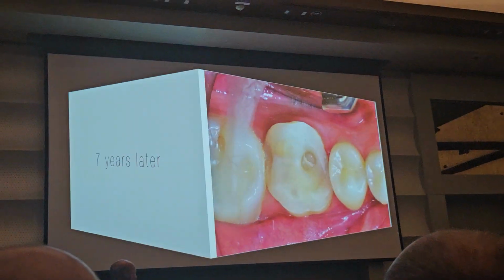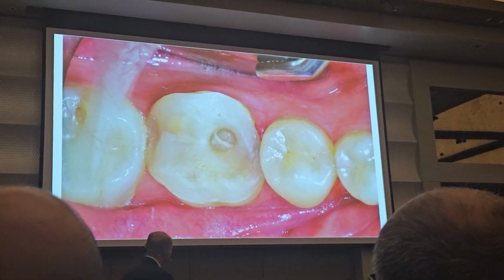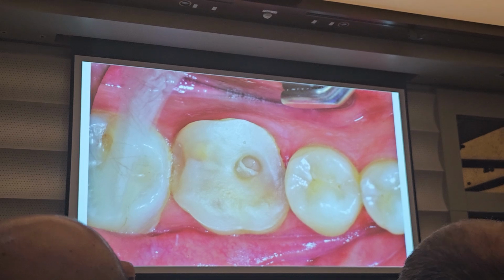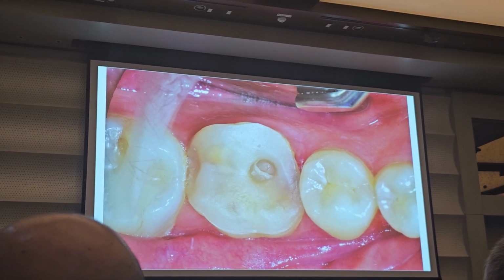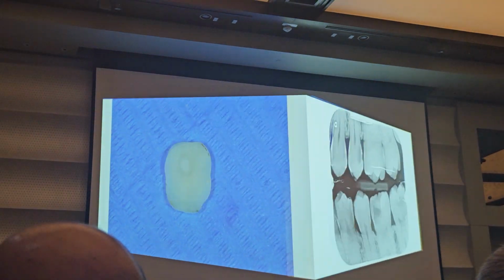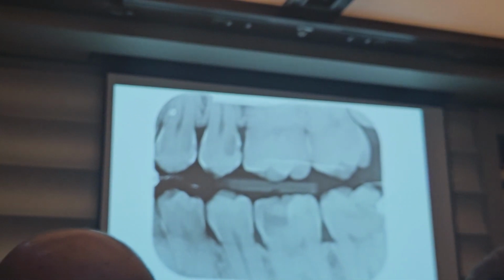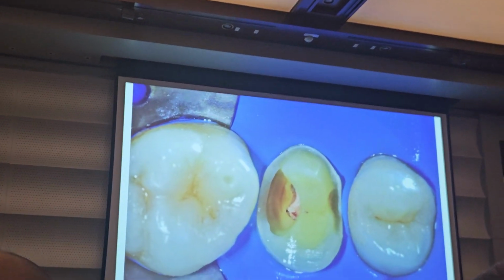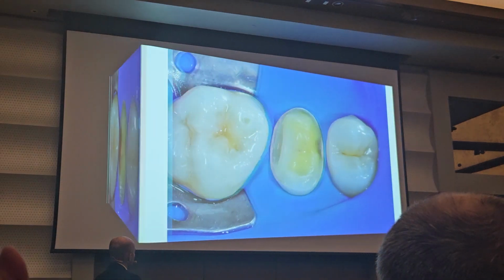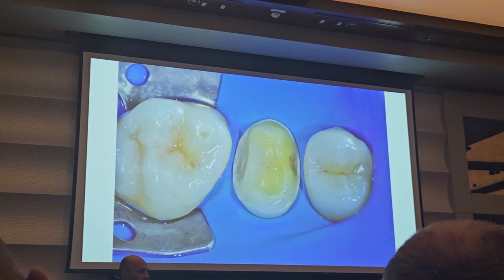Seven years later, the patient comes with the onlay in the hands after 1 week. You can see I lost completely the contact area. Okay. On the other side of the mouth, I did this other design, root canal treatments. But then I did a shoulder with more resistance on the buccal side.